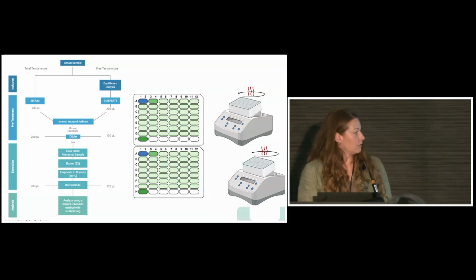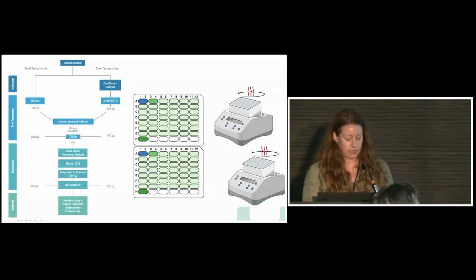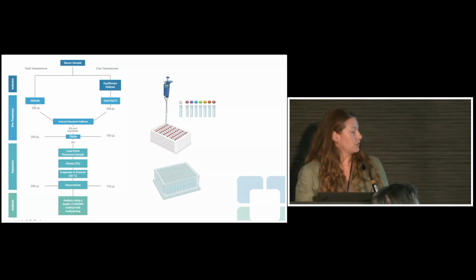And at the bottom, we've left some recovery chambers just in case somebody missed pipettes. We won't have to wait till the next day. We can keep it on the batch for today. So after we go through dialysis, we're able to pipette out the dialysate, and that will get pre-treated.